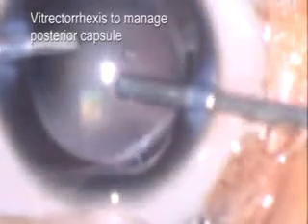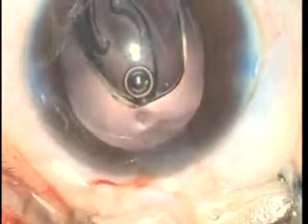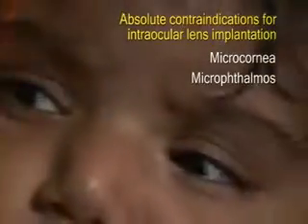The posterior capsule may also be managed by vitrectorhexis. The most preferred intraocular lenses are hydrophobic acrylic intraocular lenses. The safety and efficacy of primary intraocular lens implantation has been well established in children above 1 year of age; however, it is controversial in children under a year of age. The absolute contraindications for the use of an intraocular lens are microcornea — cornea less than 10 mm — and microphthalmia.